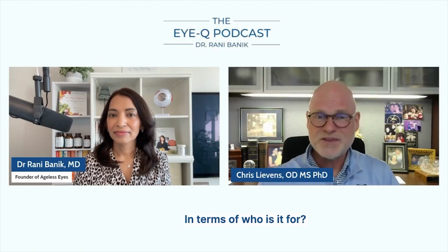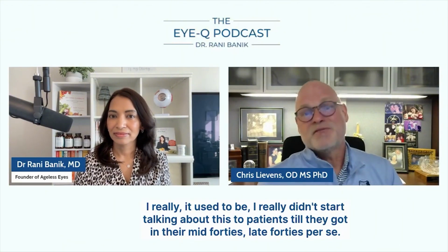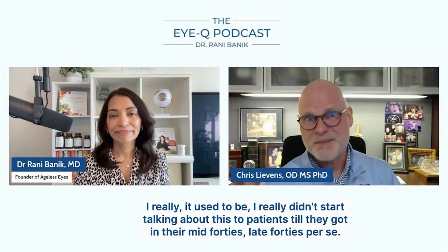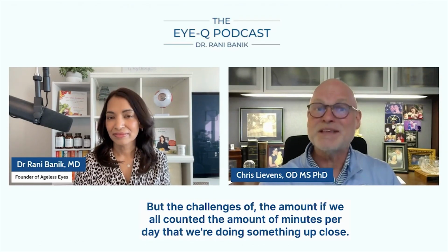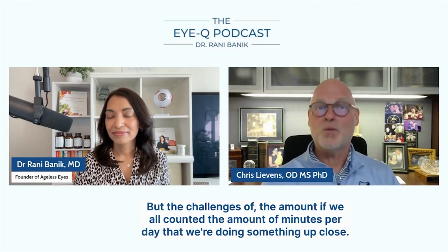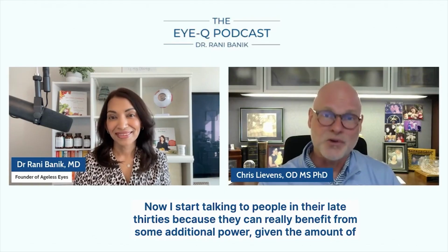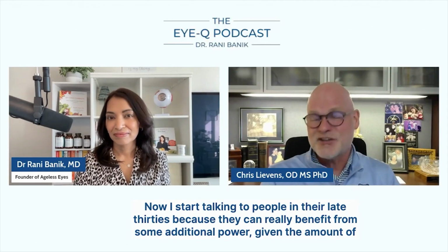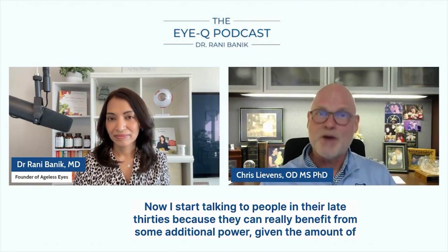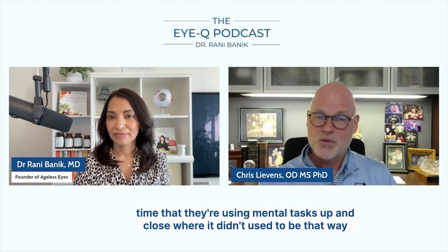In terms of who it is for, it used to be, I really didn't start talking about this to patients till they got in their mid 40s, late 40s per se. But if we all counted the amount of minutes per day that we're doing something up close, now I start talking to people in their late 30s because they can really benefit from some additional power, given the amount of time that they're using mental tasks up at close, where it didn't used to be that way.